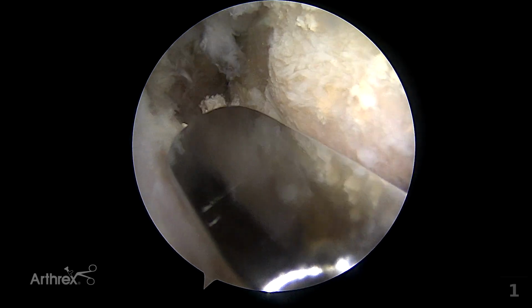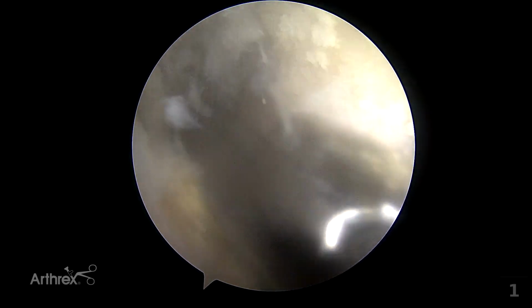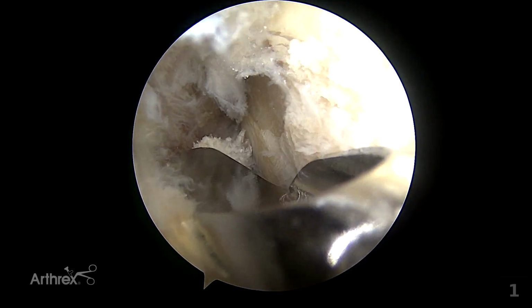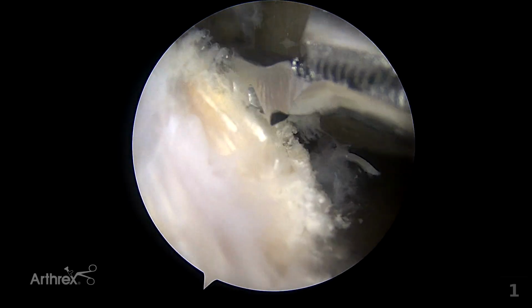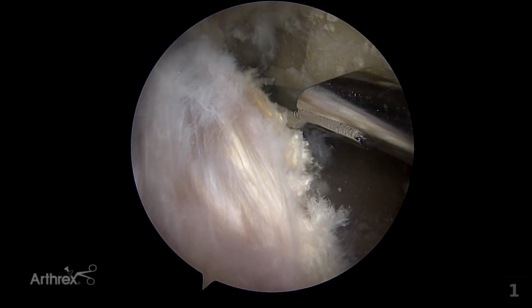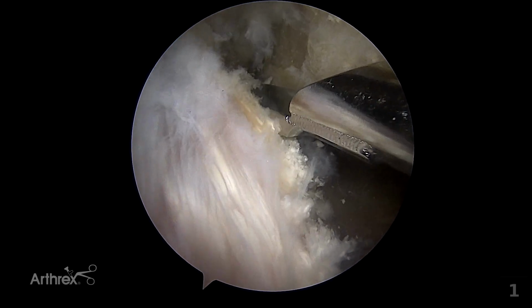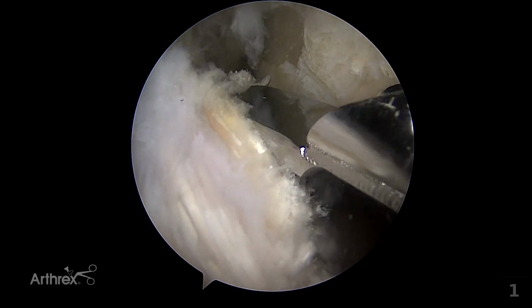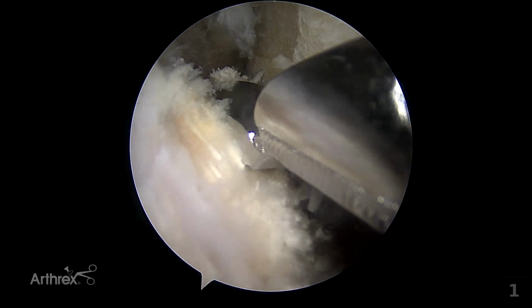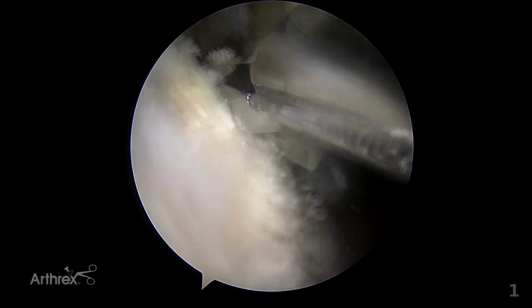So I'm just aiming down around the safe part of my ACL right here. You can feel the eminence right here. I'm on it. So I'm getting a good hand position to control it. That's bone right below me, and there's ACL right there. You can see the fibers. So I'm safely right next to it, but I know the motion's this way, so I'm not going to cut any fibers, but I'm going to, in effect, lower the floor and increase the space to be able to get to the back of the knee. So here we go.